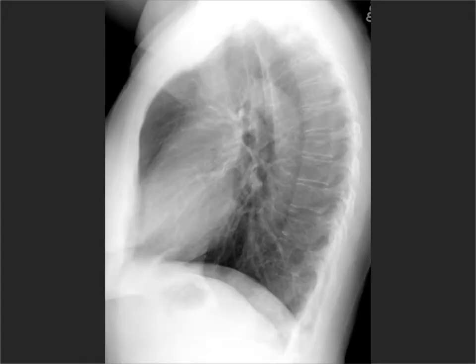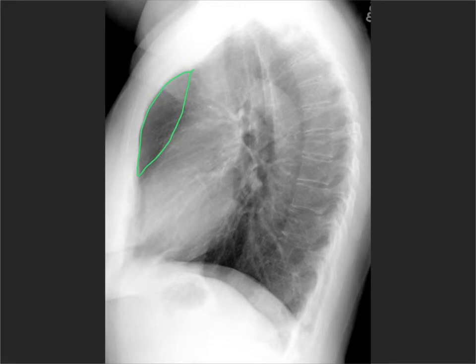So let's start with the easy stuff. This is the retrosternal space that should only contain fat. Sometimes you see soft tissue in there in kids, which is a thymus, or in patients who've had their sternum cracked because they've had bypass surgery or something like that — you can see some hazy soft tissue as well.